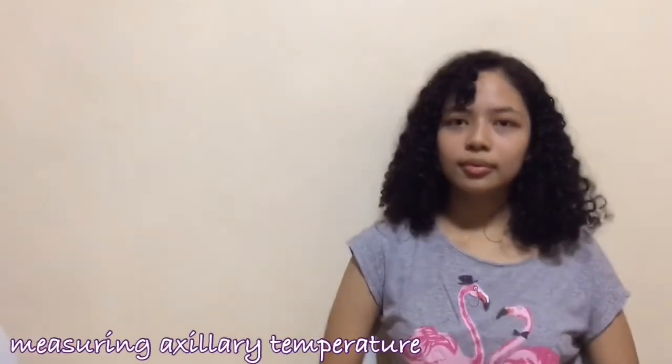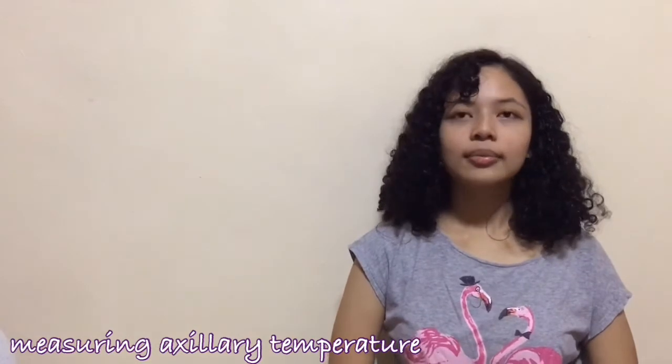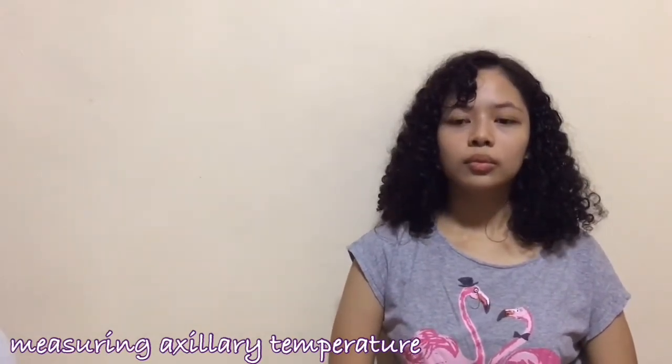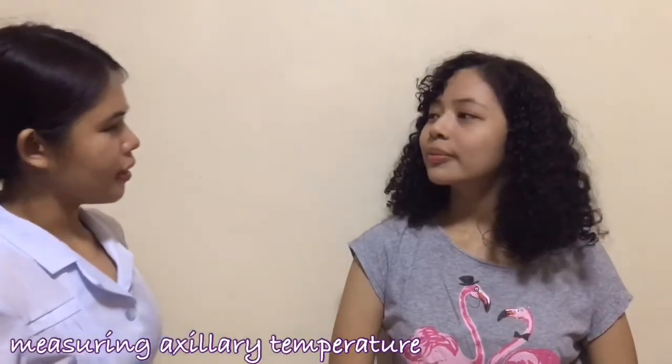I have already introduced myself to the client, verified the client's identity, explained what I'm going to do and how she can participate, and I've already performed hand hygiene. I will now measure your axillary temperature.